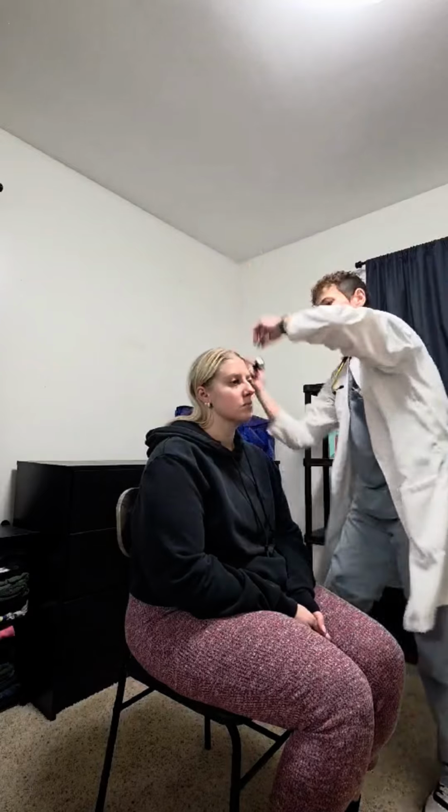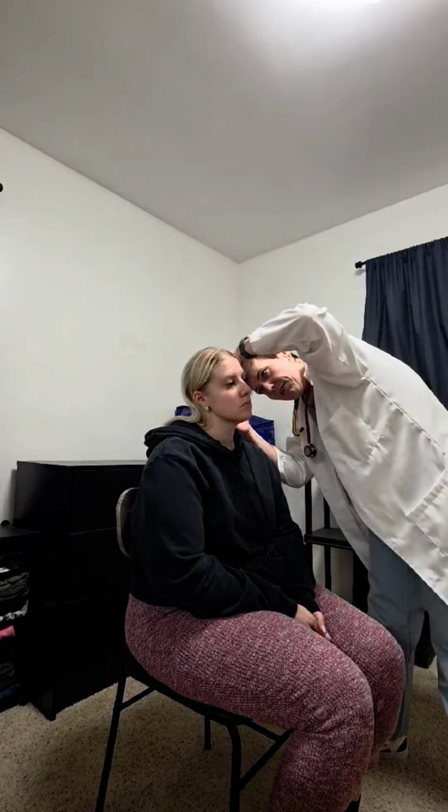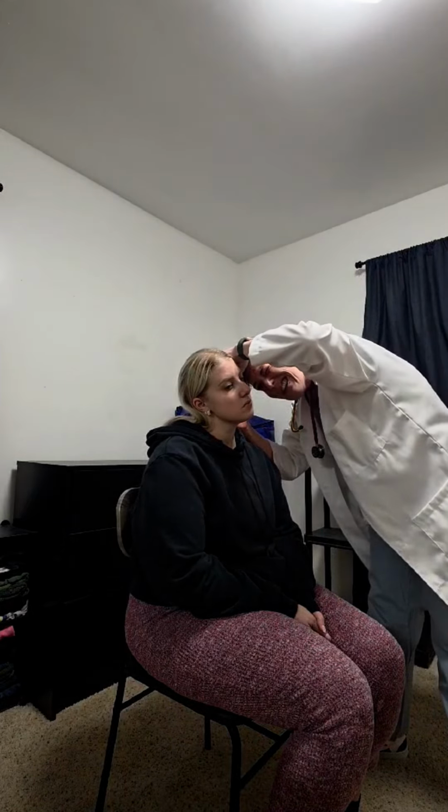Now I'm going to take a look inside of your ear. I'm going to start with the left one. Pull up and back. And let me know if there's any tenderness, okay? If you could just tilt your head to the side.